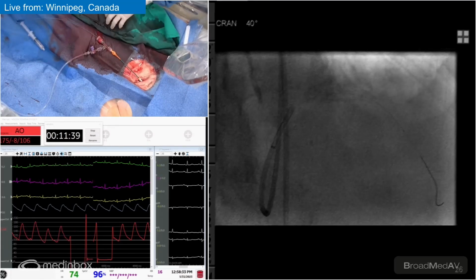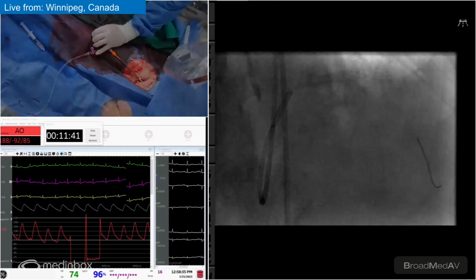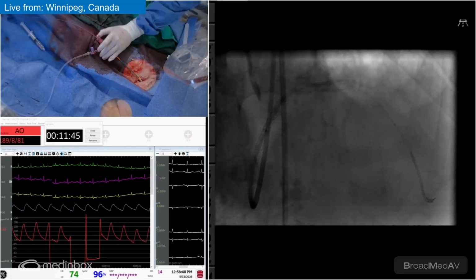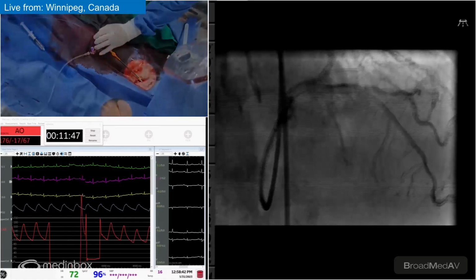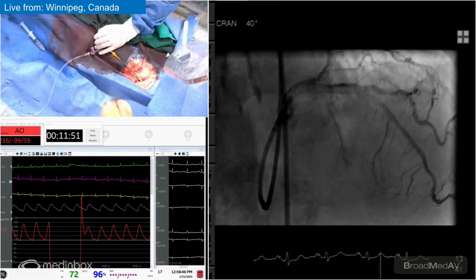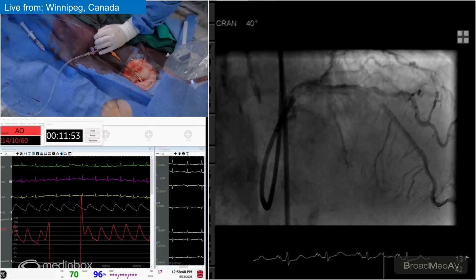You can have another 5 minutes or so. Perfect. I appreciate it. Thank you. Let's just do the angio now. At least we'll see what we have. That's brilliant. I think it looks really good. All right, we got 5 more minutes. We can walk through what the GBAT process looks like as well.